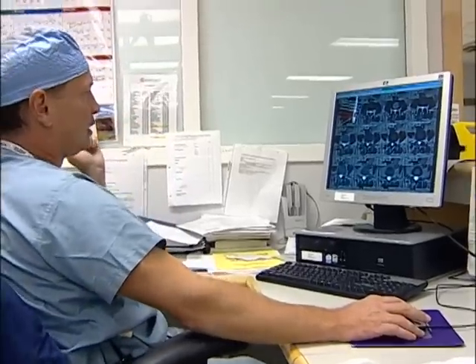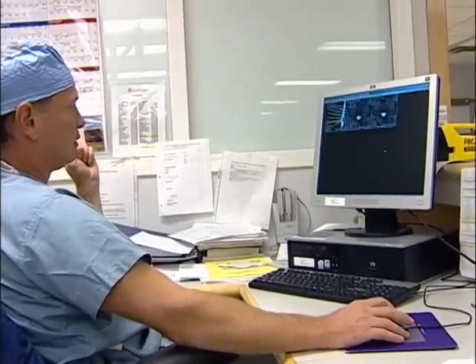The bottom line is whether you're doing it open, big open, mini open, or what we're soon going to be doing, which will be a true multiple port endoscopic. At the end of the day, you can accomplish it safely without compromising the objectives, without compromising the stabilization, without compromising the reconstruction, and with the use of biologics, lessen dead space, improve surface area. We're seeing fusion rates that are approaching high 90s percentile.